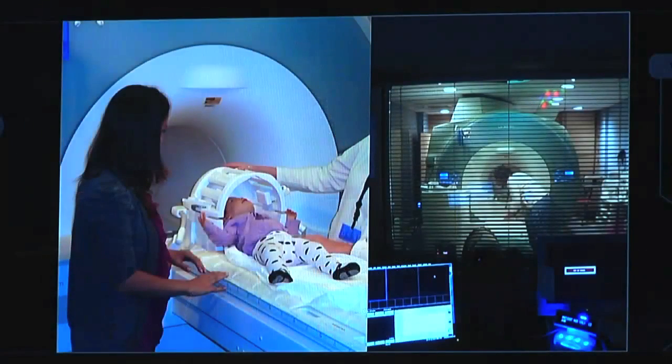So when you do MR scans, you sit outside at a scanner console, the patient is inside because the magnet is so strong, it's like 1.5 Tesla, 3 Tesla, or even 7 Tesla, that the room has to be MR safe, and all metal objects have to be removed because otherwise it's very dangerous. You can be killed if something gets sucked into the scanner when you're laying there. On the other hand, being scanned by MR is completely harmless for the patient. So that's why we can scan even pregnant women and analyze the fetus inside the stomach.